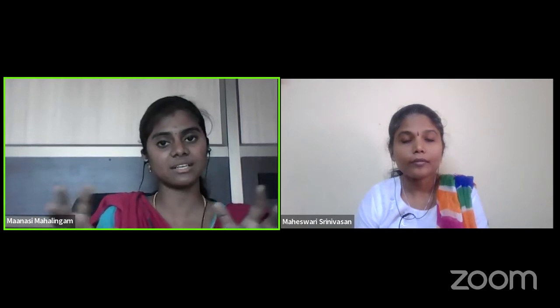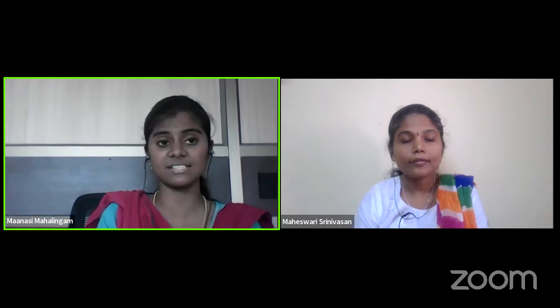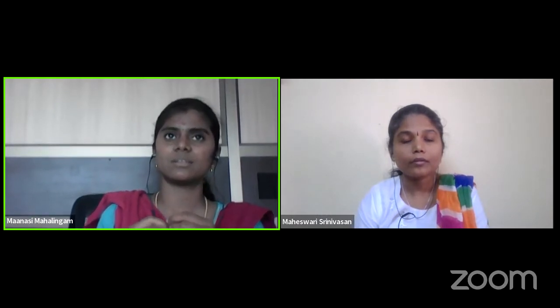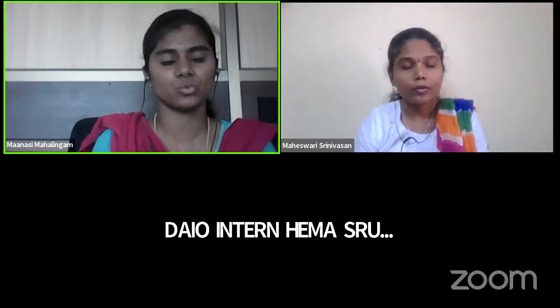And then we found whether it can be a biomarker for a patient for whom the disease is in early stage and for whom it is in advanced. There is one software that is very widely used, ma'am, which is called Fiji and ImageJ. And there are a few other applications like Angio Tool. I am aware of only these two, but there are so many. But commonly used is the Fiji.